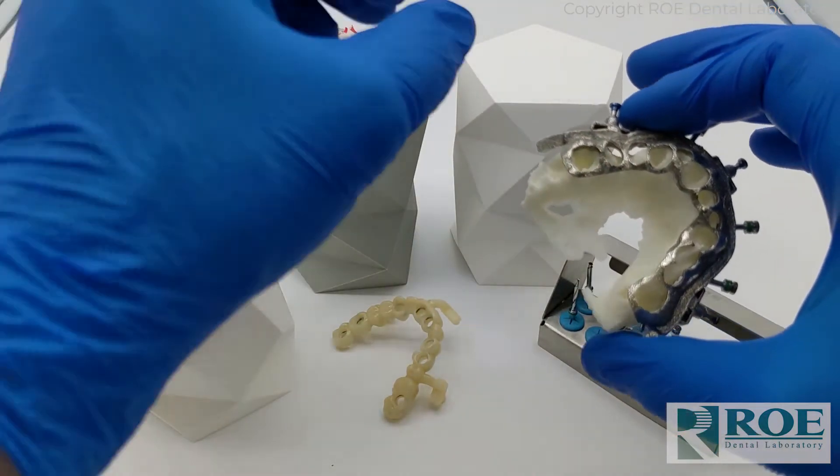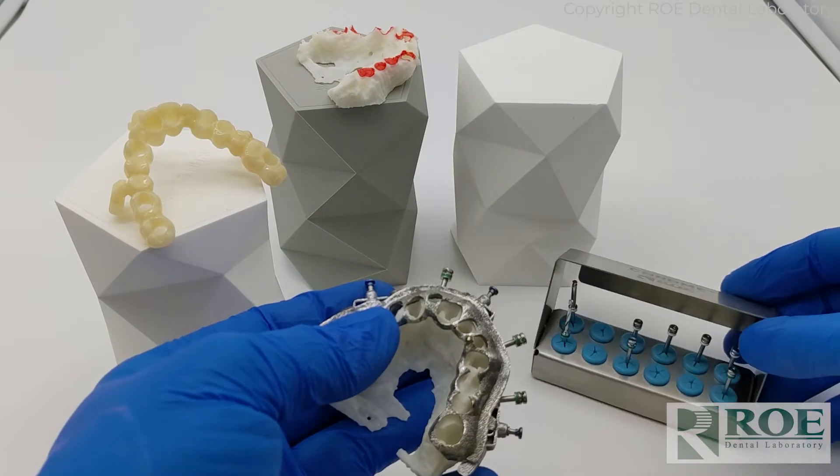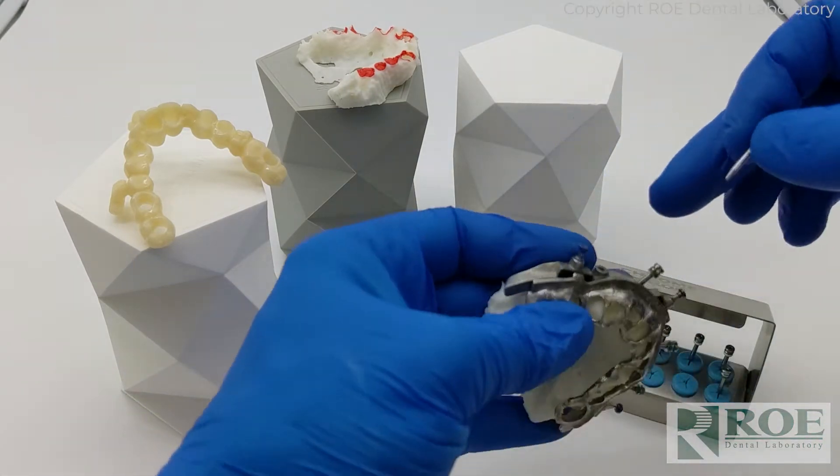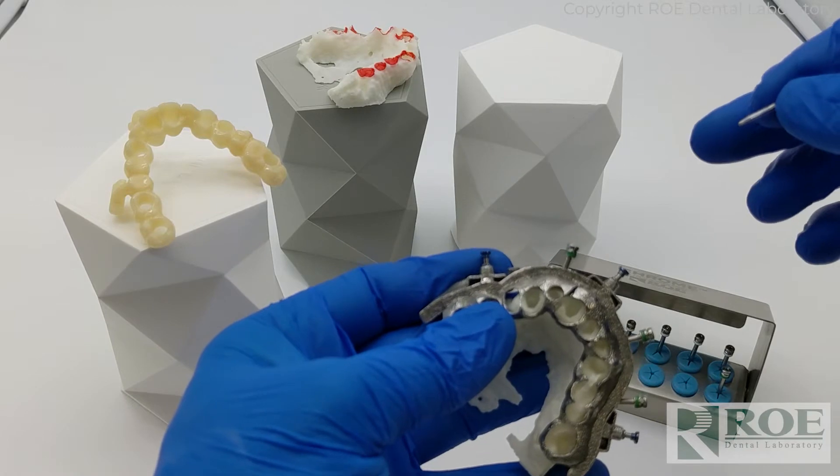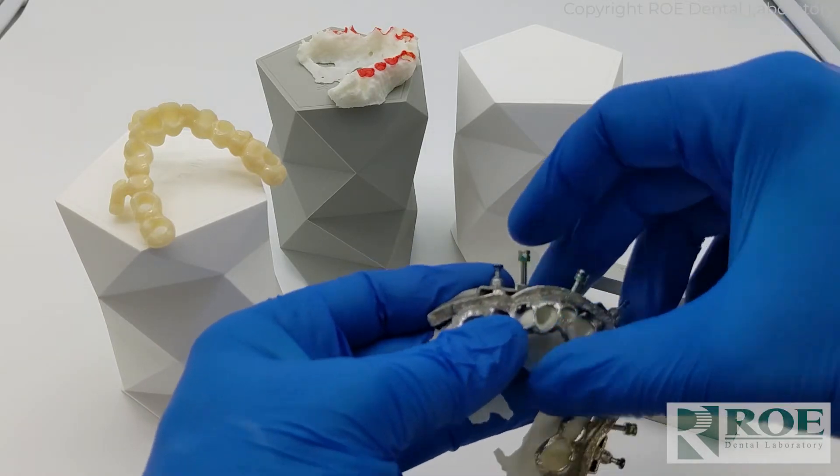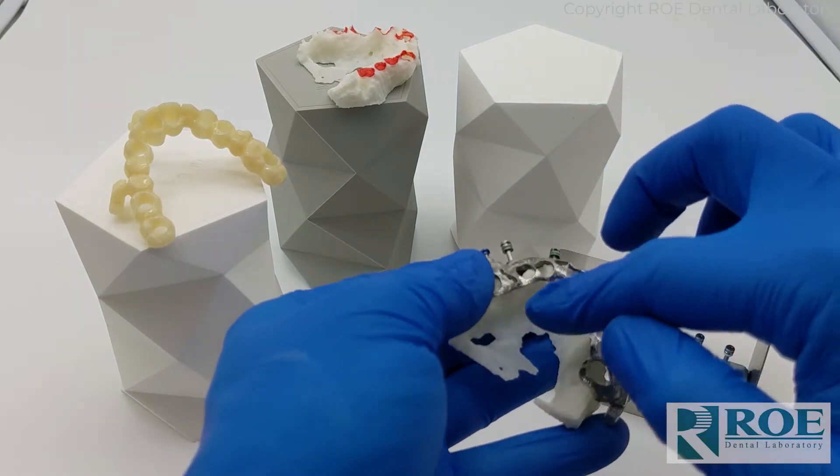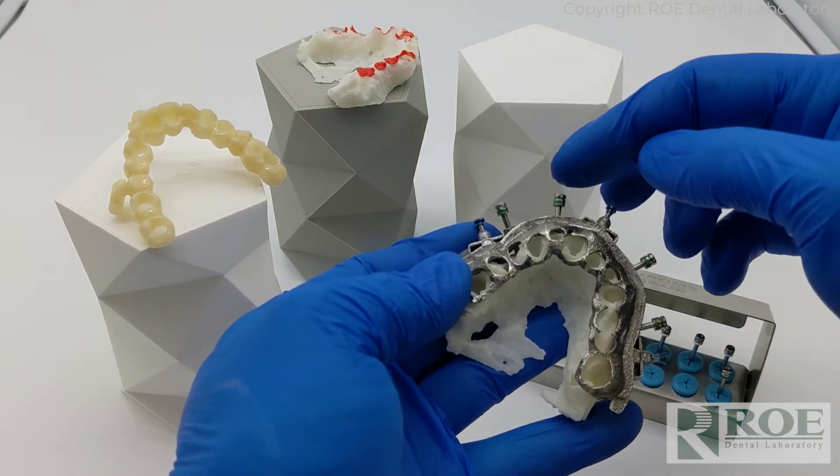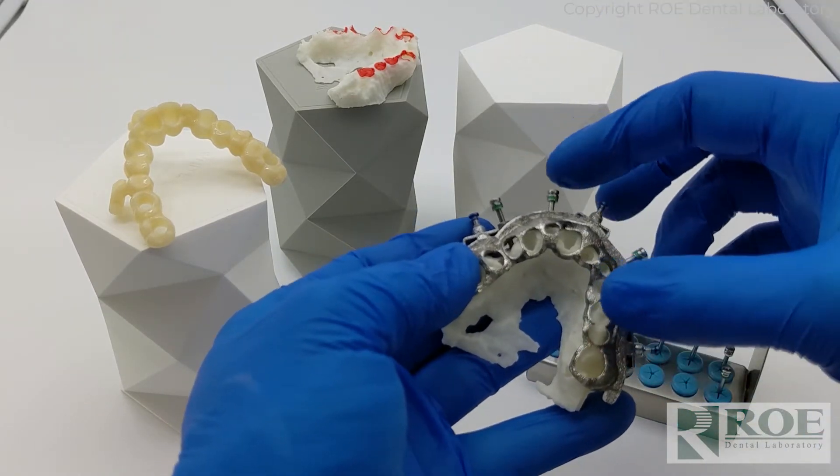We pin the fixation base to the bone model here in the laboratory with our kit. These holes are not completely drilled out, that's why you'll see the pin sticking out. Obviously these should be flush.